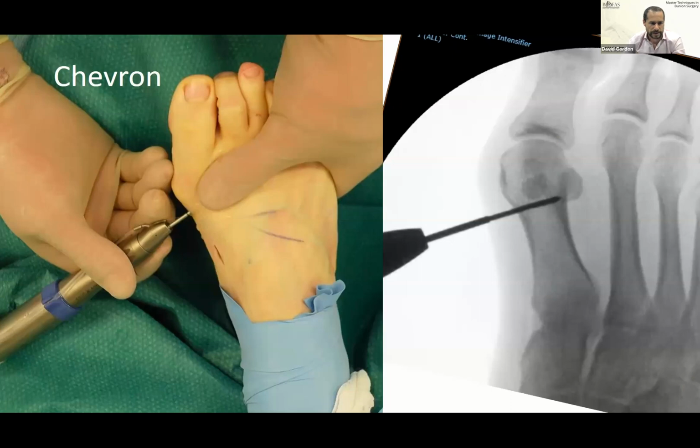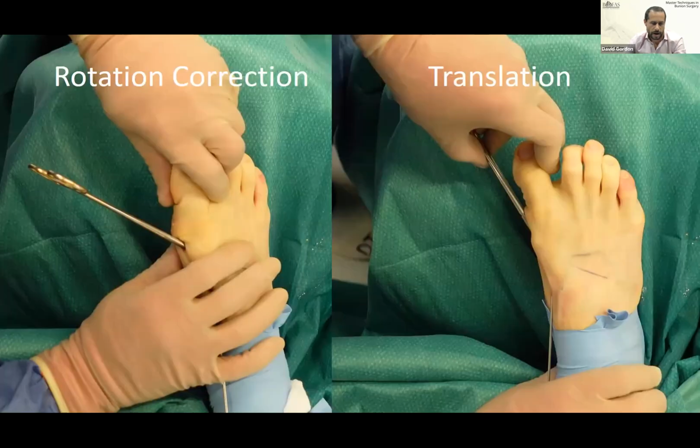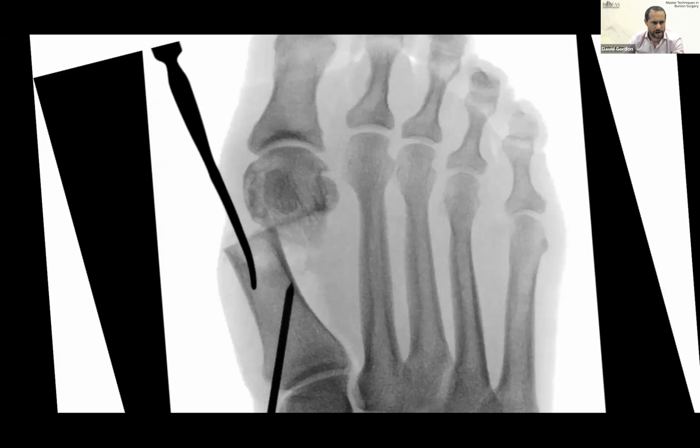So the first step is using your burr to perform a Chevron Osteotomy. So that's a dorsal and plantar cut. Then once the osteotomy is completed, you can correct the rotation of the metatarsal head and the hallux. And then the metatarsal head is translated laterally with a lever. So intraoperatively, you've got a lever pushing the head over, and you can push it as far as is required, but normally I push it 95%.